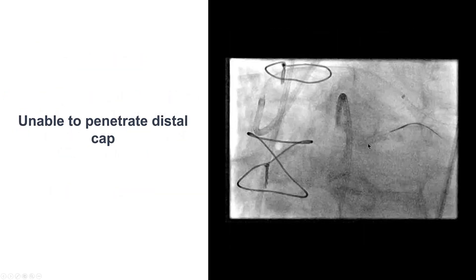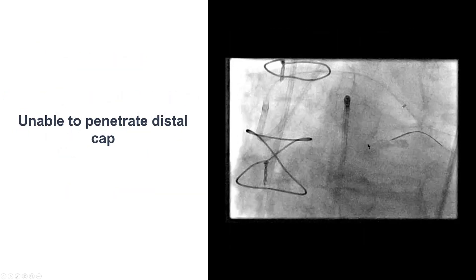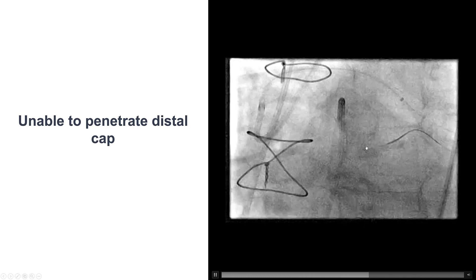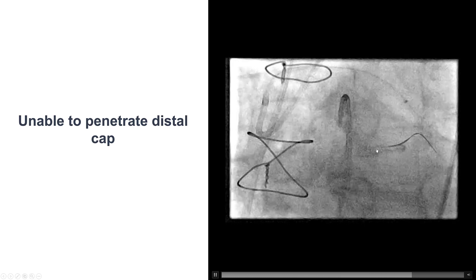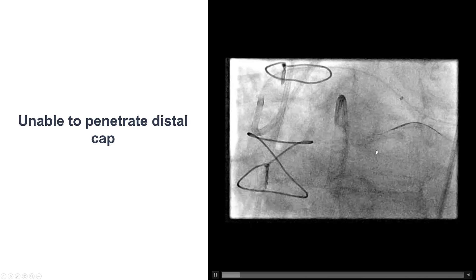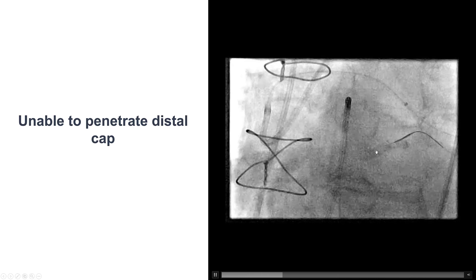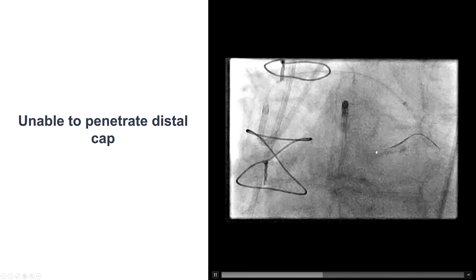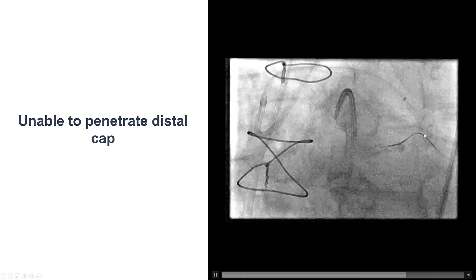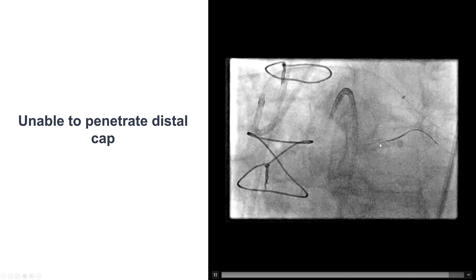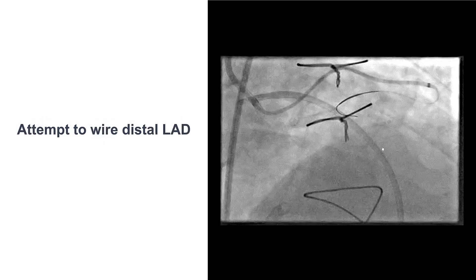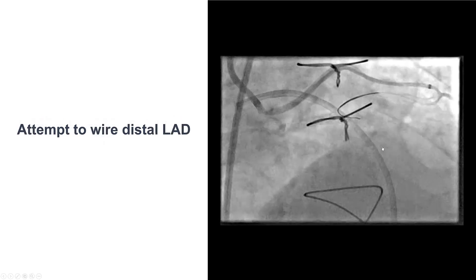This is not uncommon when we have previous bypass graft, because the distal cap is exposed essentially at systemic pressures, which makes the distal cap more calcified. We can see that the guide wires do not really make much progress.